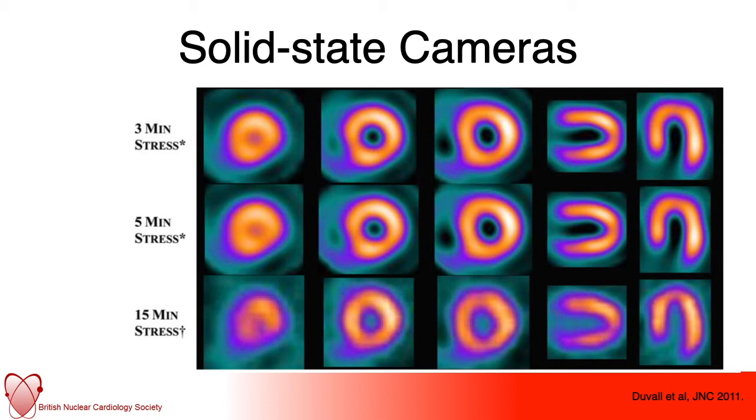a 5-minute image acquisition but inject a little bit less. And therefore, just depending on your workflow and your patient population, you can actually reduce the radioactivity these patients are receiving while also reducing scanning times.